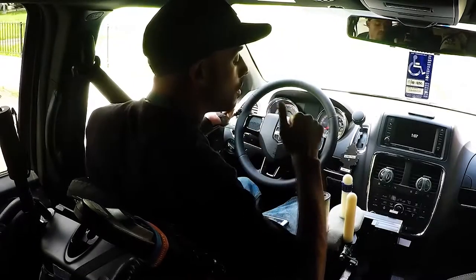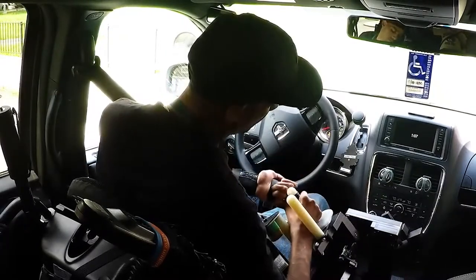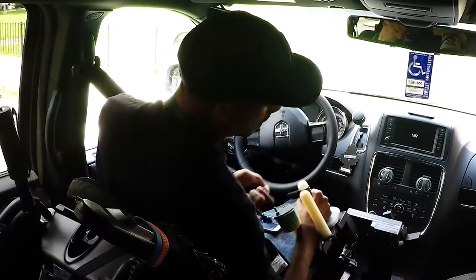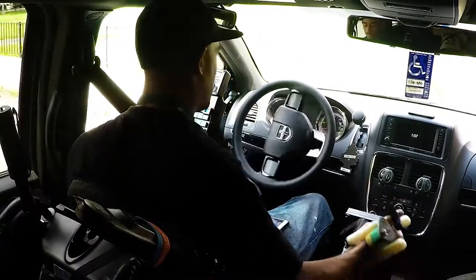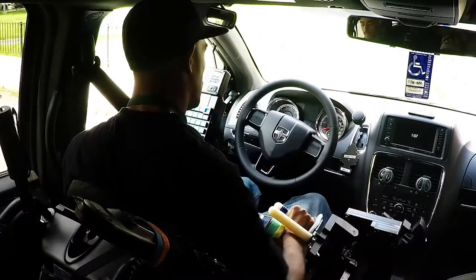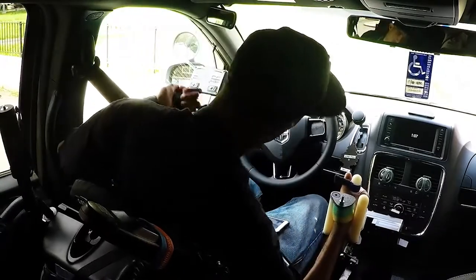Here you see me placing my hand into what I use to control the vehicle. I rotate it right to steer right and left to steer left. Forward is gas and back is brake.